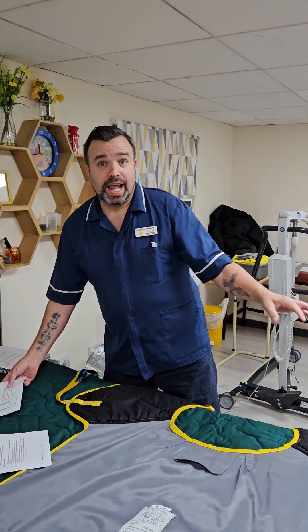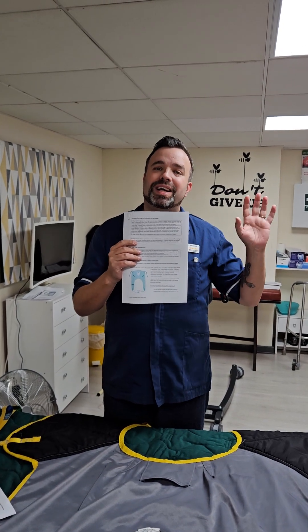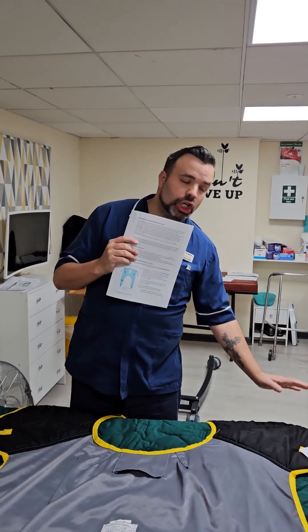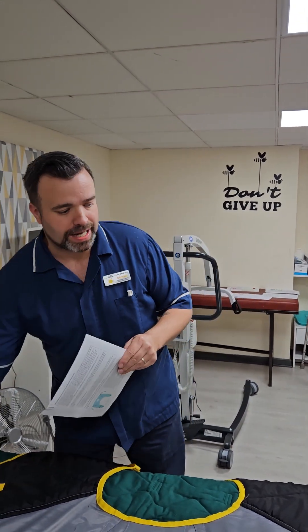Finally, we have the Standard Operating Procedure, known as the SOP. The SOP is a set of instructions written for each piece of moving and handling equipment. It's really important as a member of staff that you have read this SOP, because the risk assessment will refer to it — it will say which sling to use, which loop to put it on, and explain how to use the sling. So that's your paperwork for the sling.